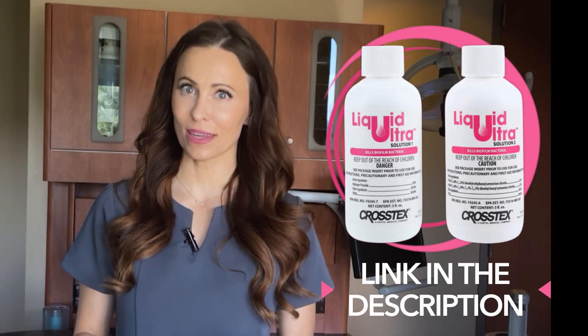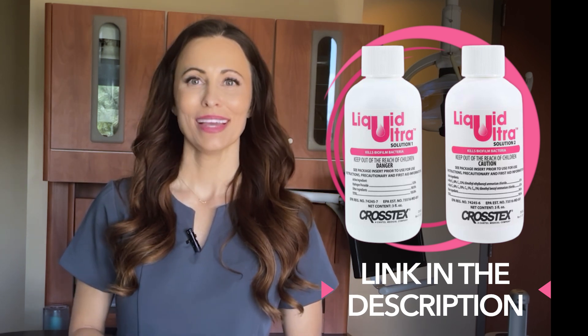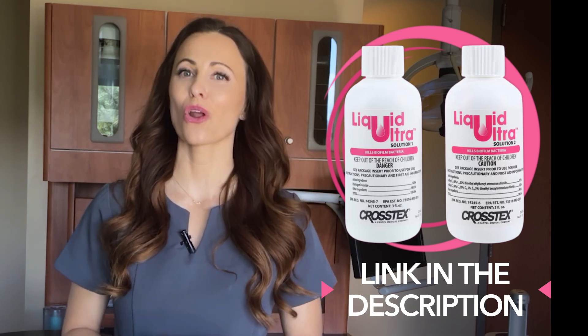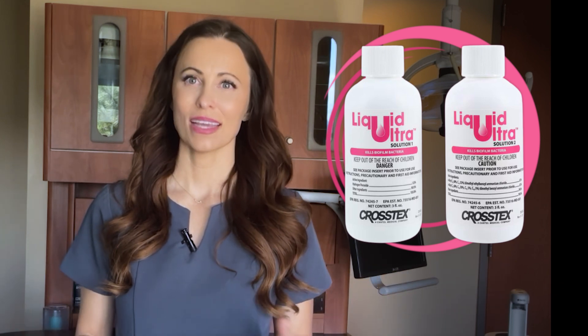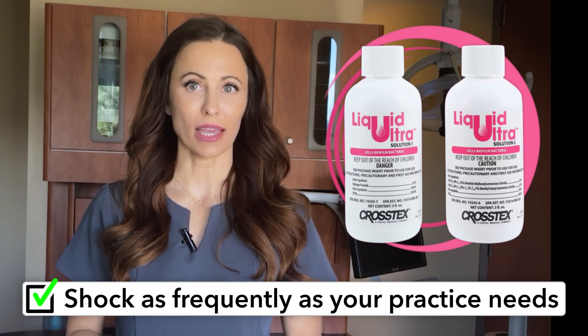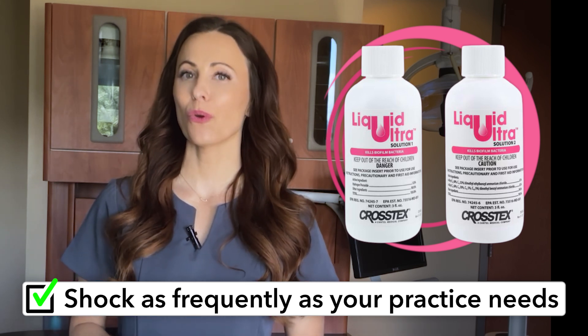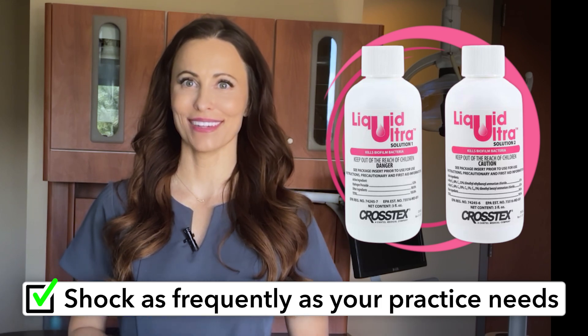These products are specifically formulated to target and eradicate biofilm, ensuring your water lines are thoroughly cleaned. Depending on your practice's needs, periodic shocking — perhaps quarterly or more frequently — will keep your water lines in optimal condition.